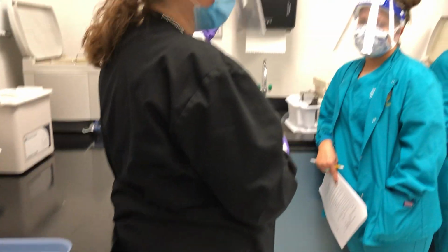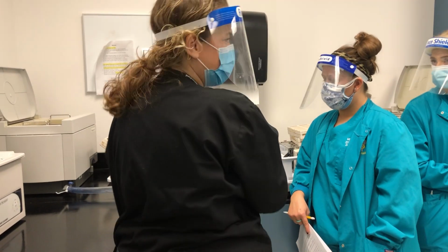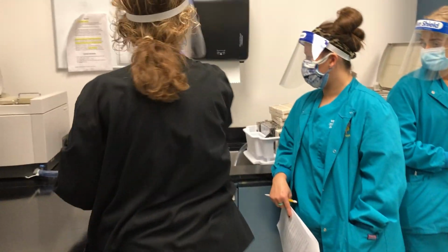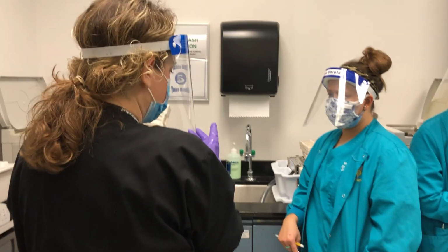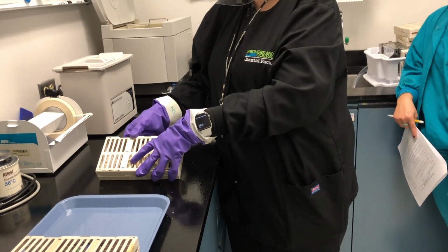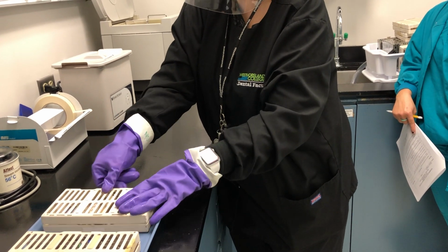Yeah, so that's what I was going to say. So we magically are dry already. We have two dry ones. This is TV time, we always say. So you're going to go ahead and grab one of the dry ones. This is still contaminated, so we're going to have our purple gloves on. We're going to set it on the countertop, and you can set it right on the countertop, or you can set it back on your tray, whichever.